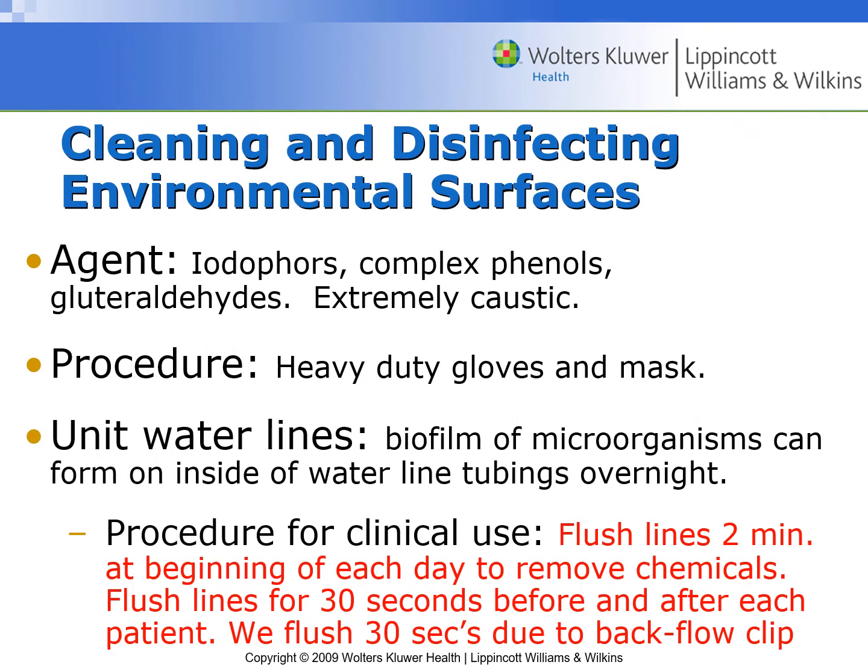So cleaning and disinfecting environmental surfaces, the agents, iodophors, complex phenols, glutaraldehydes, they're extremely caustic. And so you want to have on utility gloves, heavy duty utility gloves, and a mask when you are cleaning your chairs and the countertops around the sink, the doors to the cabinets, etc.